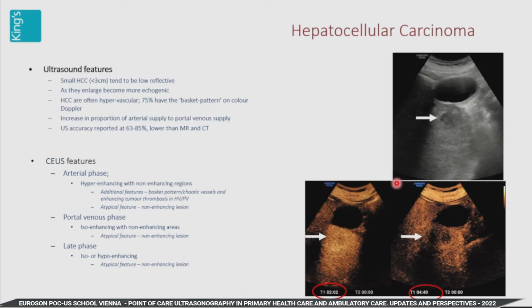Hepatocellular carcinoma is a bit more difficult, and I'll do a little bit more on this because you are relying on a patient having underlying liver disease, chronic liver disease, usually a hepatitis B or C. And we've got about 9,000 hepatitis patients in our clinic at King's. So we do a lot of surveillance ultrasound, and we do a contrast-enhanced ultrasound on newly seen nodules that appear in the liver to see if we can stop, again, downstream costs of the CT and MRI.